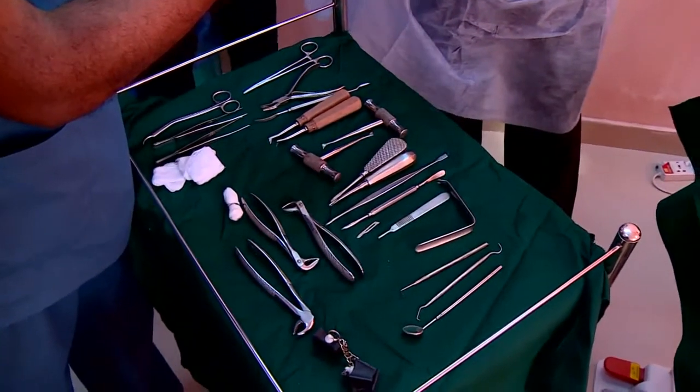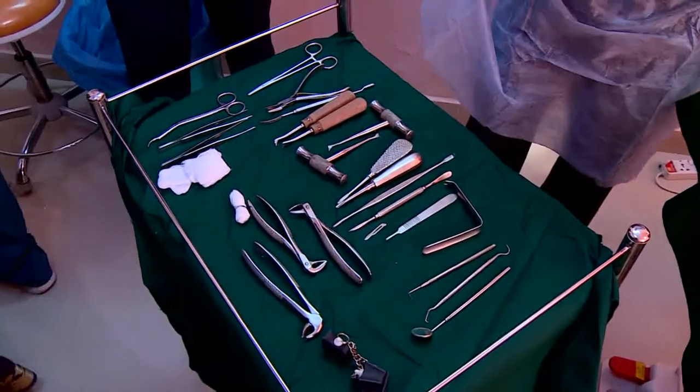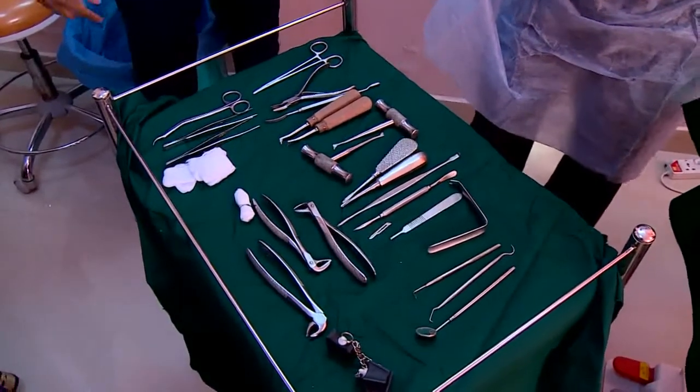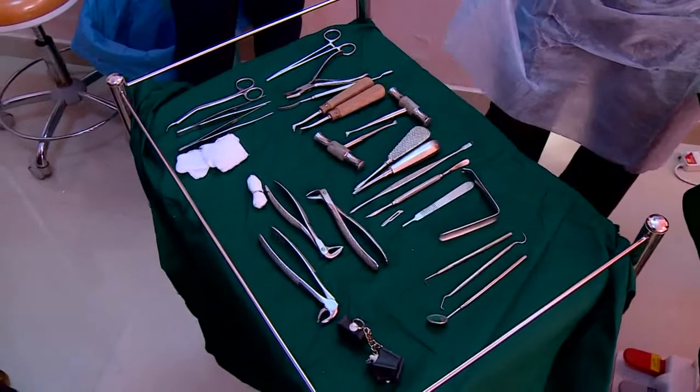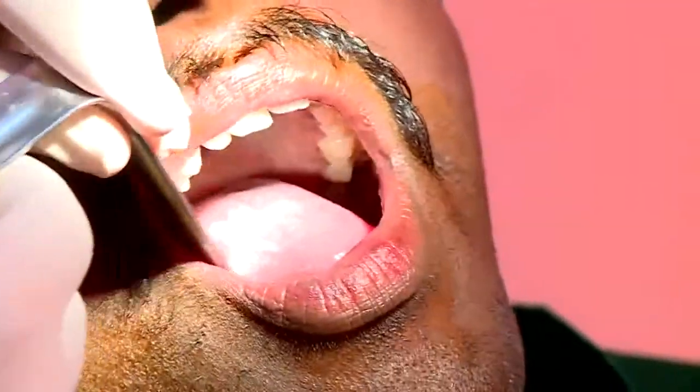Okay. So, you have the Austin's retractor, the right angle retractor to reflect the soft tissue and the flap. This is the number 3 and number 7. They are the two BP blade handles that you have. Just exposing the impacted tooth. Just I want to show the impacted tooth.